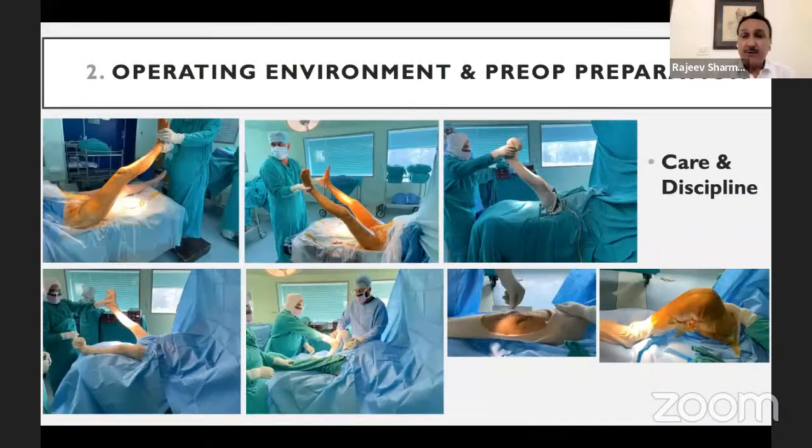The operating environment and the pre-operative preparation of the patient are very important. I prepare my patient from toes to the groin with a proper adhesive sterile iodine drape applied in the perineal area, so that the perineal area is separated off. Both legs can be done simultaneously, prepared very safely.